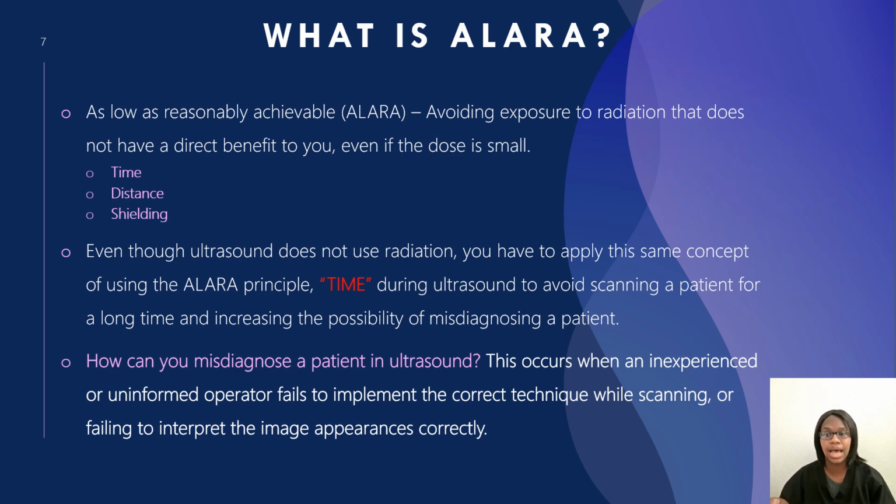When it comes to time, you do not want to be in the ultrasound room scanning their breast for a long time because you may have a high chance of misdiagnosing a patient. So, as a technologist, if you don't know what you're looking at, go get the radiologist, go get another ultrasound tech. I know a radiologist trained me to do breast ultrasound.